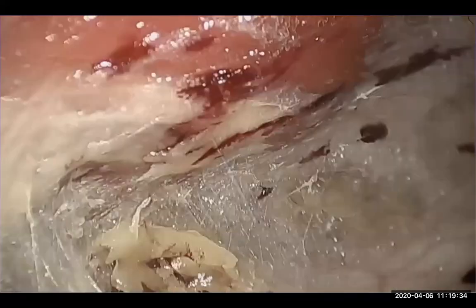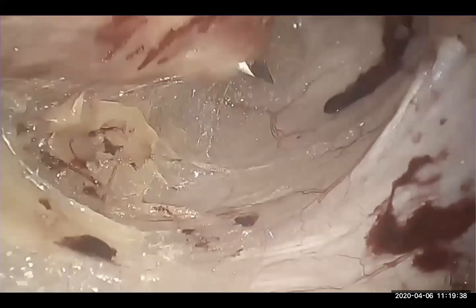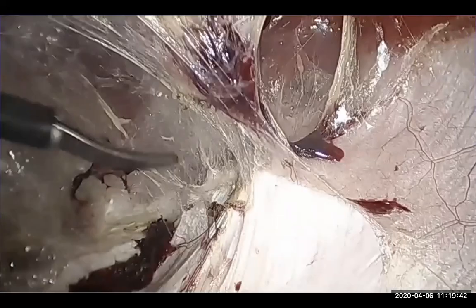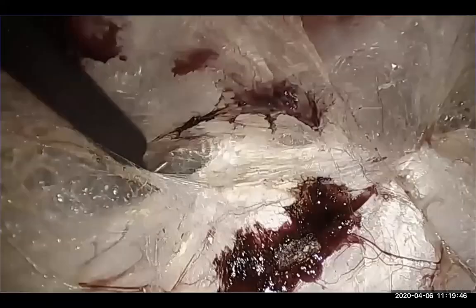You get just on the surface of the PRS and go through the areolar tissue. Now you're inside. Now, lateral part of the rectus muscle, medial to the linea semilunaris, don't go through a neurovascular bundle if you can help it, and put in an instrument and take down the areolar tissue and avoid excessive bleeding.